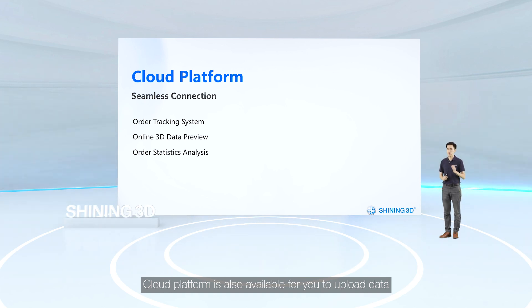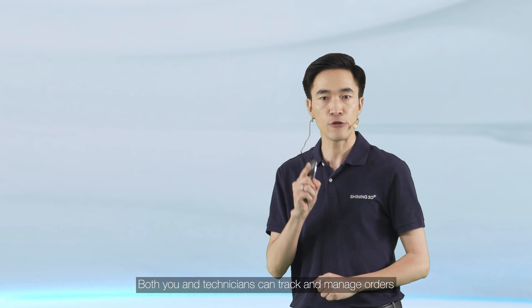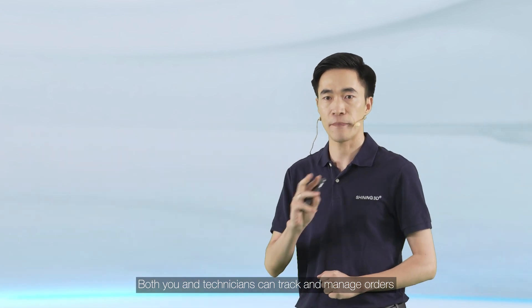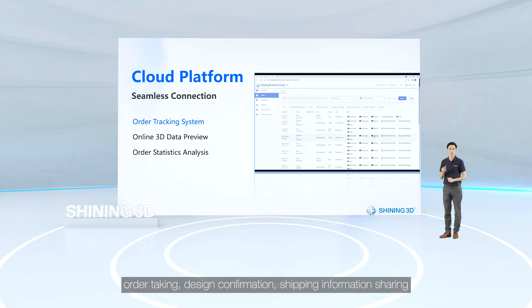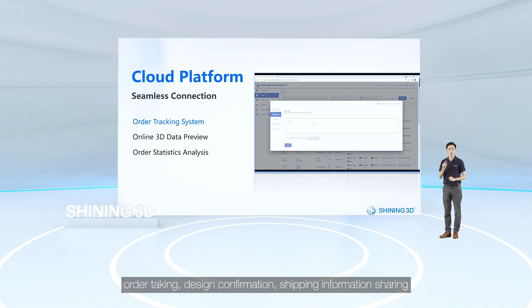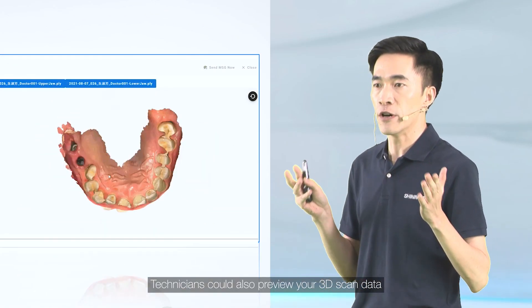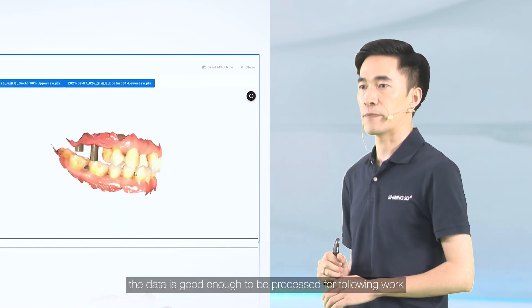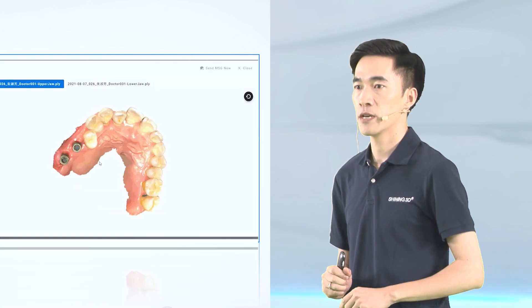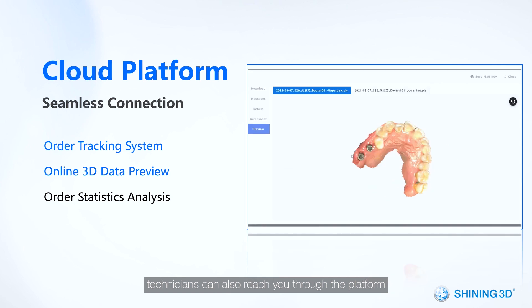A cloud platform is also available for you to upload data and for technicians to download it. Both clinicians and technicians can track and manage orders through the platform efficiently for following steps like order uploading, order taking, design confirmation, and shipping information sharing. Technicians can also preview your scan data to ensure it is good enough to be processed.